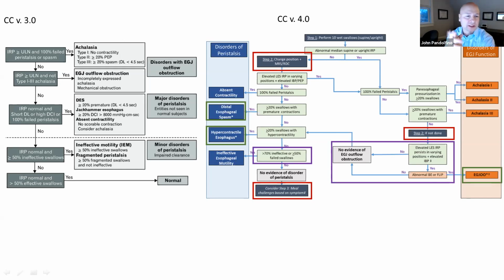qualification for the diagnosis, or an absolute requirement, but they're there to help you formulate the diagnosis, because many times when you're doing this, you don't get a conclusive diagnosis and you're having to work around and getting complementary tests to get a conclusive diagnosis in the end.